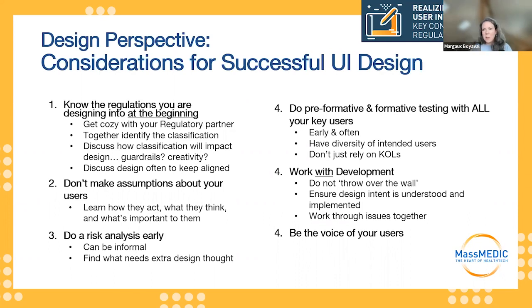Oftentimes, when you get caught up in details or you're working on documentation, you forget to go back to what the users need. And often design is a representative for the users and what they're aiming to achieve through a solution. So you can go to the next.